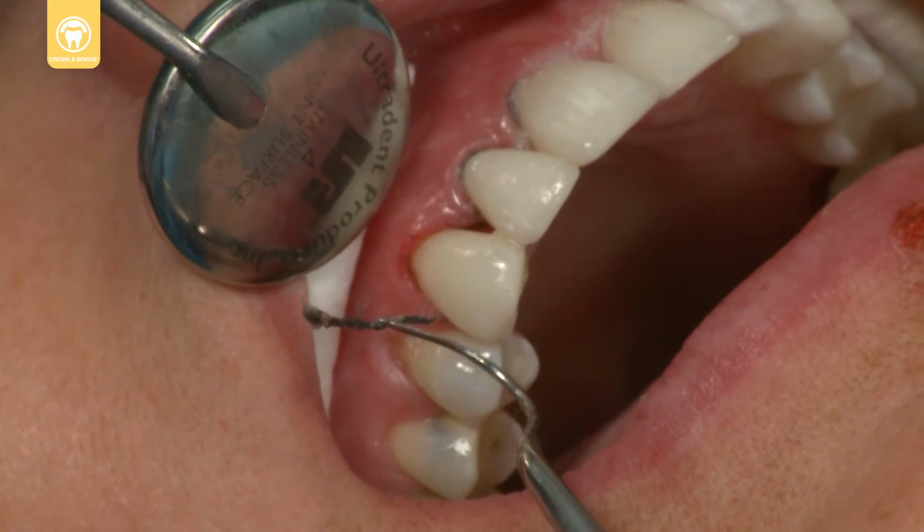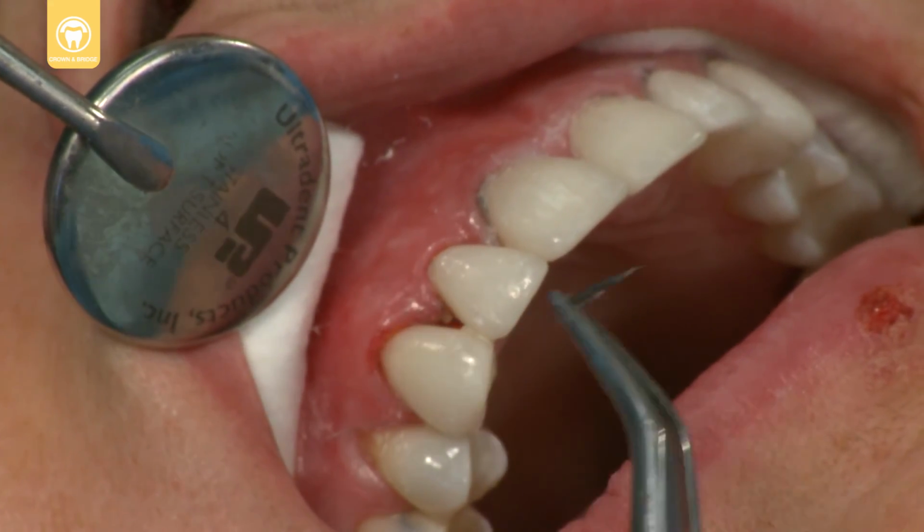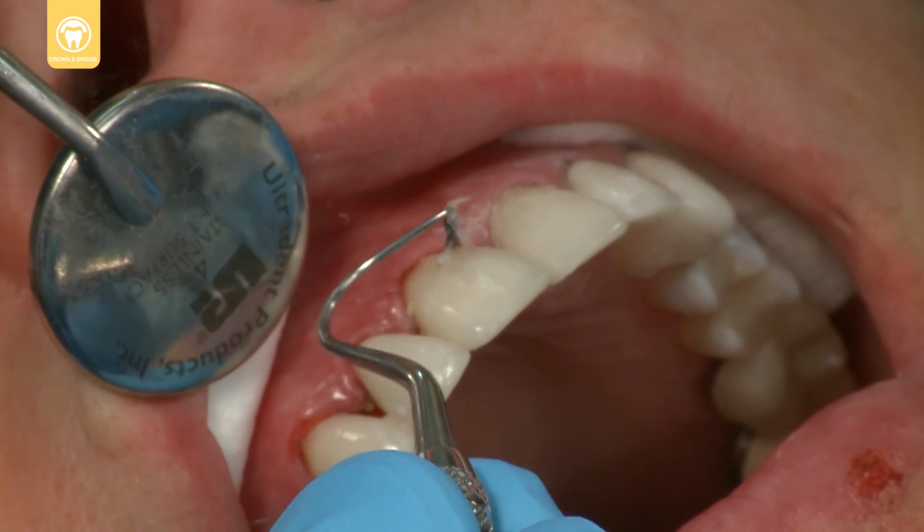Finally, remove the Ultra-Pack knitted cord, remove excess flash, finish and polish the margins, then rinse and dry.